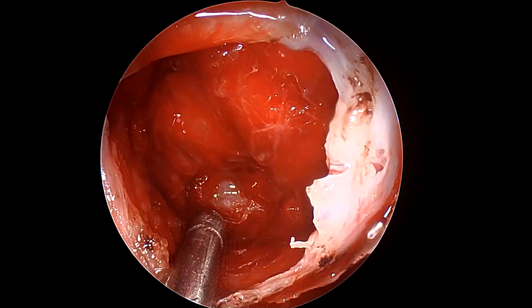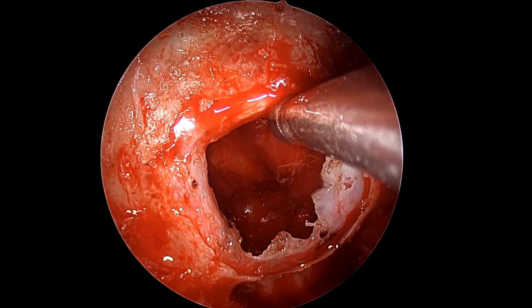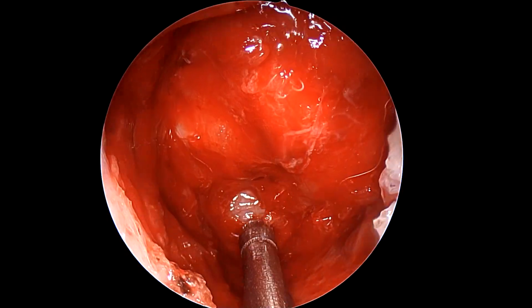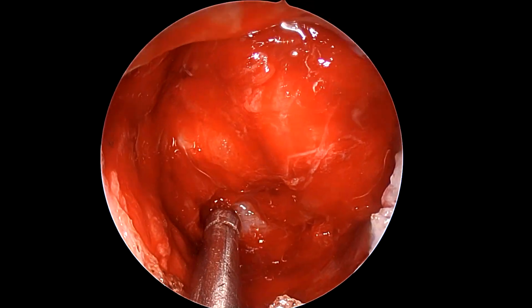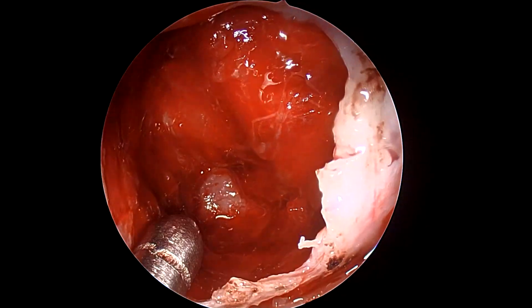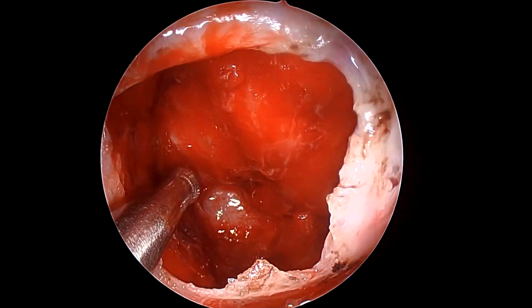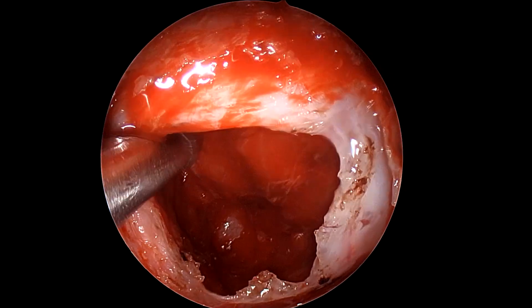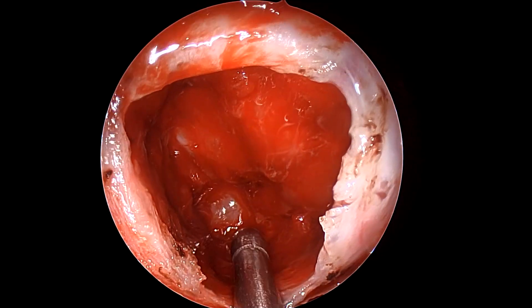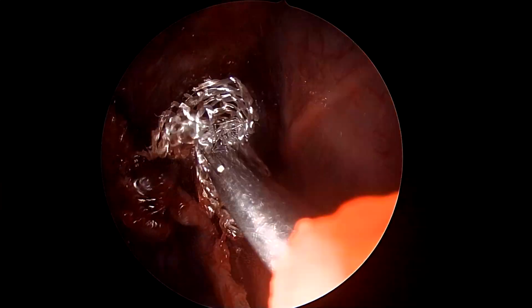So you see here how posteriorly we have practically reached the limit, and we can see the posterior dura of the sella, which is clean and doesn't show any tumor. But of course, there is tumor on the lateral side, on the right side, and we'll see if we can remove a little bit of it comfortably, without any attempts to remove every last bit of it, because that would really be counterproductive.